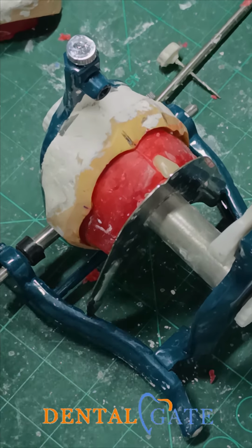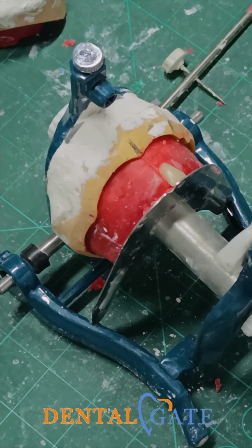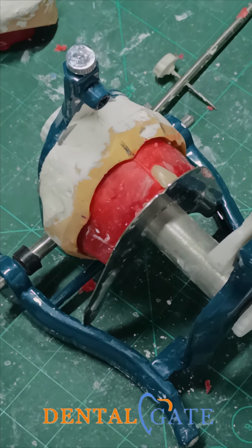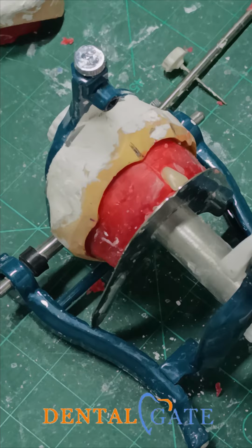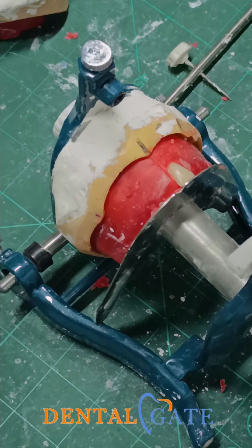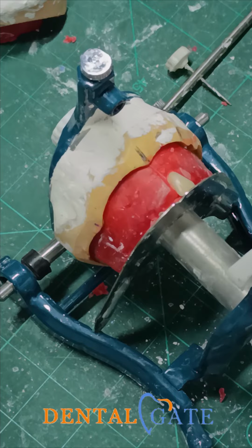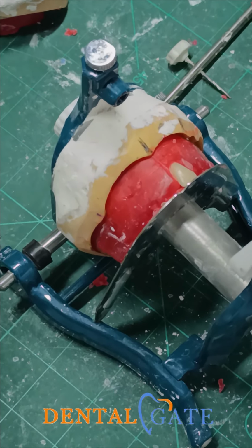I will make the lower according to the upper, okay? Some companies provide special tables for the lower. We can make it by the lower criteria, and the upper should be set according to the lower. But the easier one for practice is to start with the upper, okay?